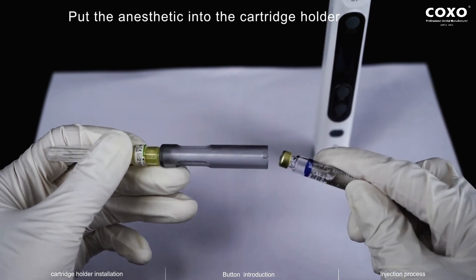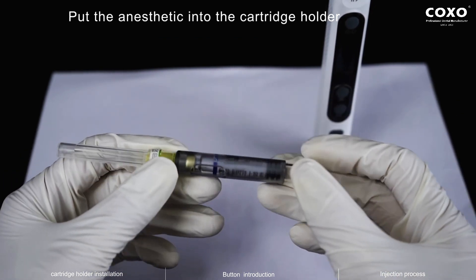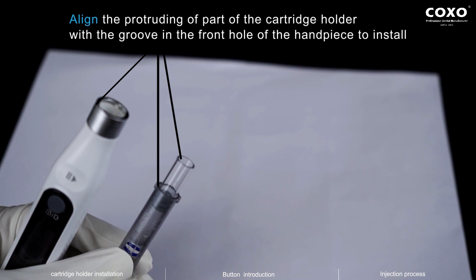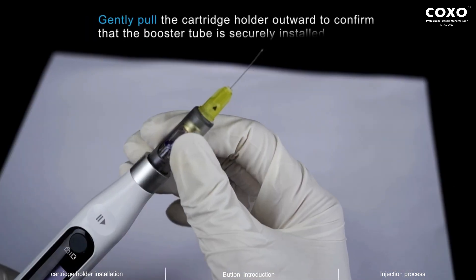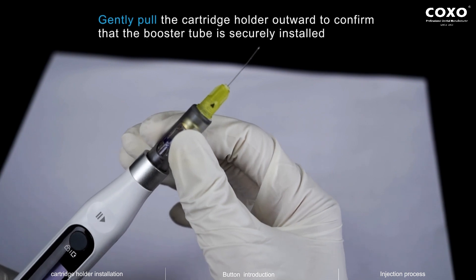Put the anesthetic into the cartridge holder. Align the protruding part of the cartridge holder with the groove in the front hole of the handpiece to install. Gently pull the cartridge holder outward to confirm that the booster tube is securely installed.